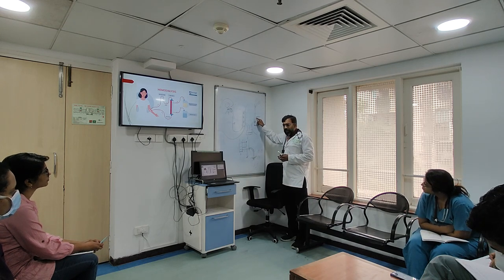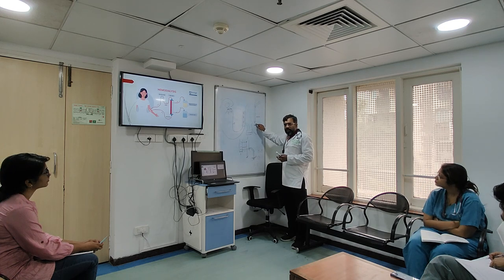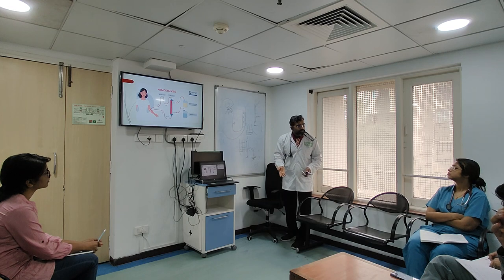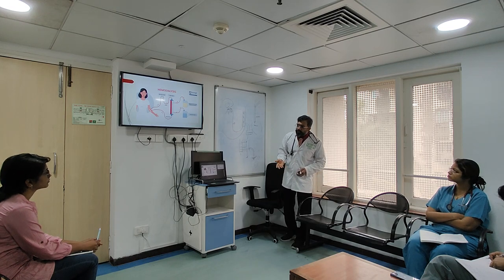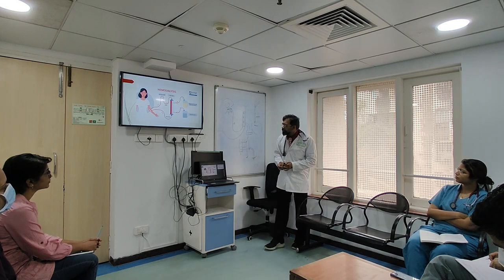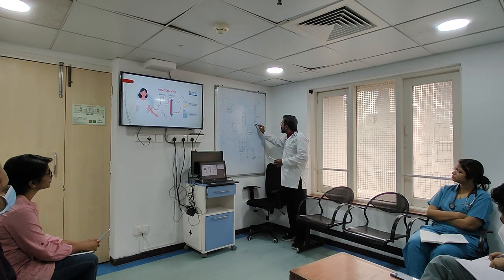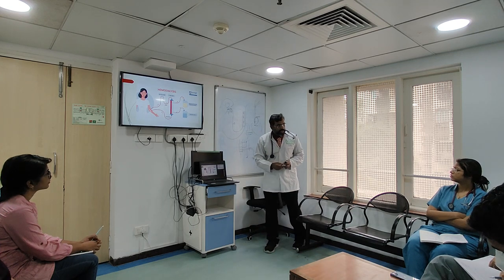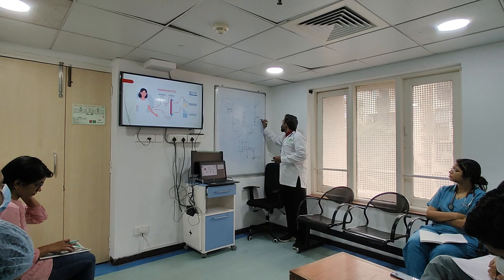Are you understanding? If I move this from here to here, I am actually reducing the efficiency. What I am filtering, I am taking back in. That makes sense, right? So this phenomenon that happens over here is called access recirculation. It is called access recirculation.